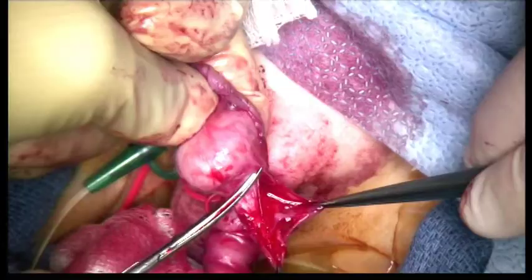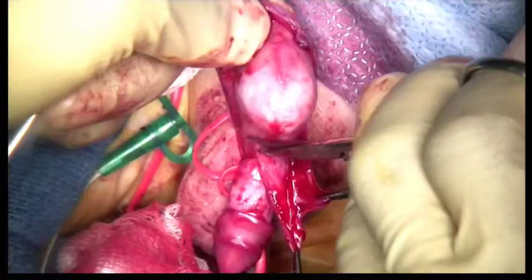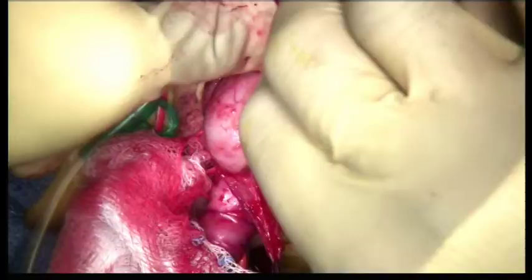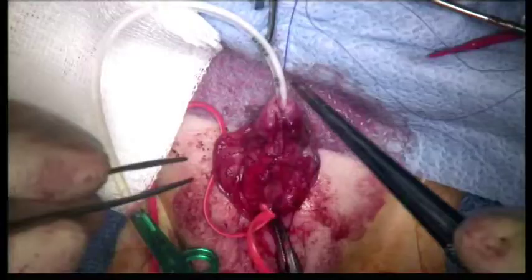A vascularized layer of tissue along with its blood supply is dissected from the dorsal foreskin. This vascularized layer is tacked in place over the neourethra and serves as an additional barrier to possible breakdown and fistula formation.